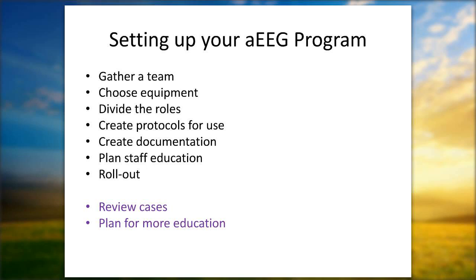And I think that what's important is to know that you need to just constantly be reminding people about the value of aEEG, about the uses of aEEG, and then to provide them with some case examples of how it's been working in your unit so that they can really become passionate about using it.